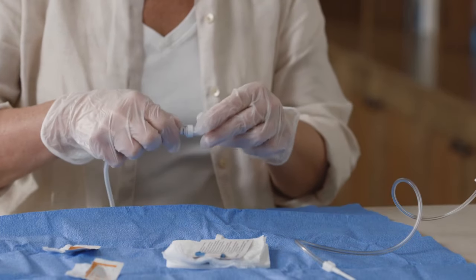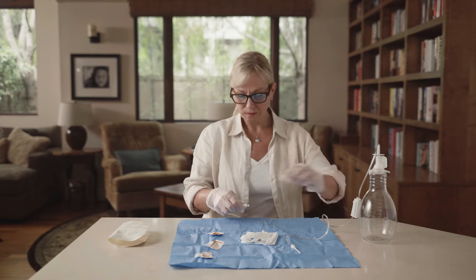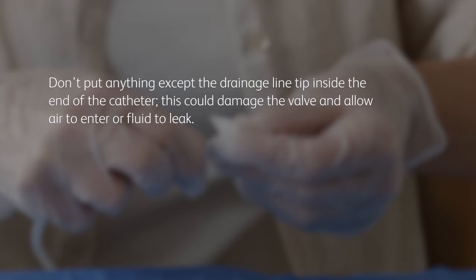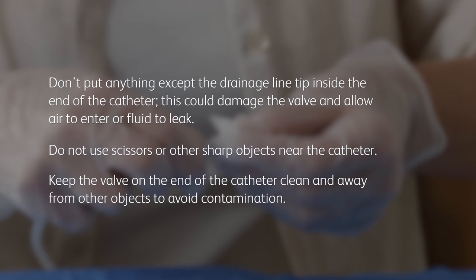Holding the catheter near the end, remove and discard the cap from the end of the catheter. Use an alcohol pad to clean around the opening, but don't try to clean the inside. Don't put anything except the drainage line tip inside the end of the catheter — this could damage the valve and allow air to enter or fluid to leak. Do not use scissors or other sharp objects near the catheter. Always keep the valve on the end of the catheter clean and away from other objects to avoid contamination.